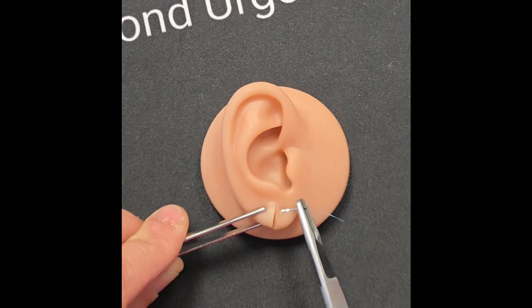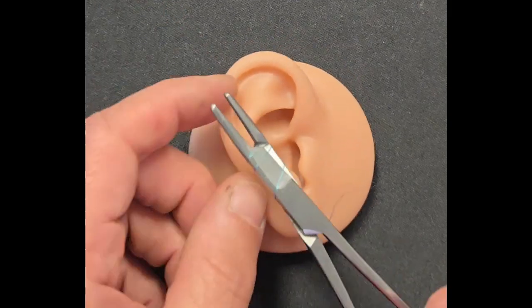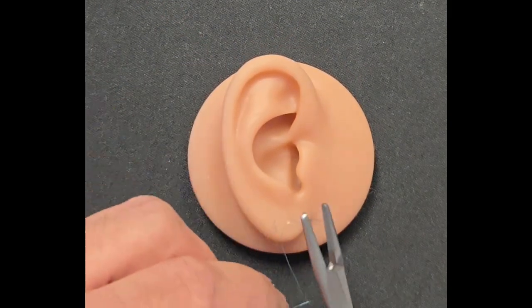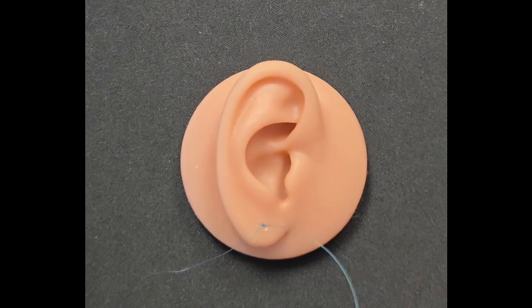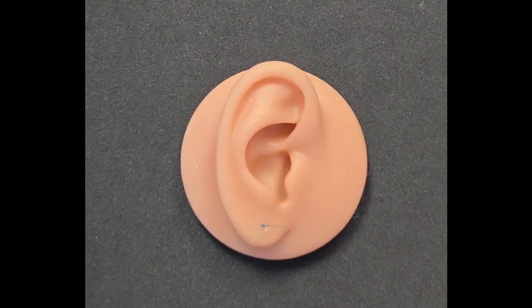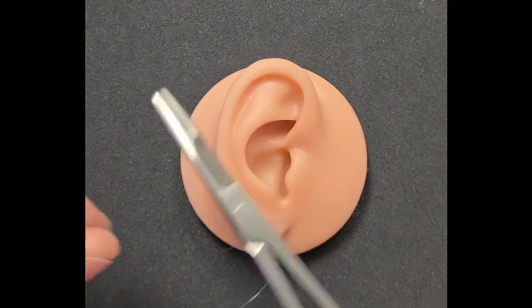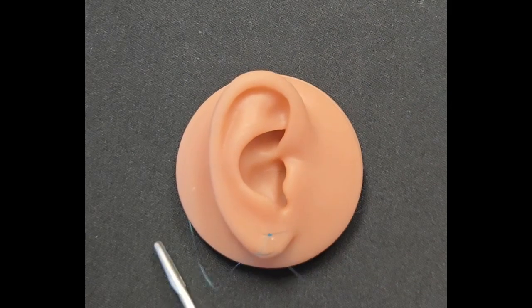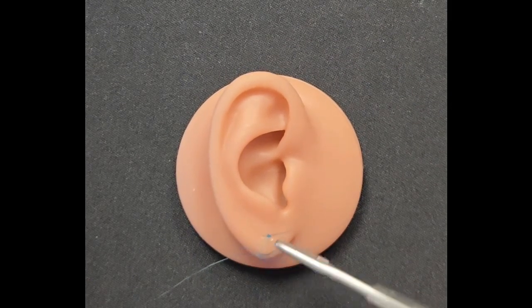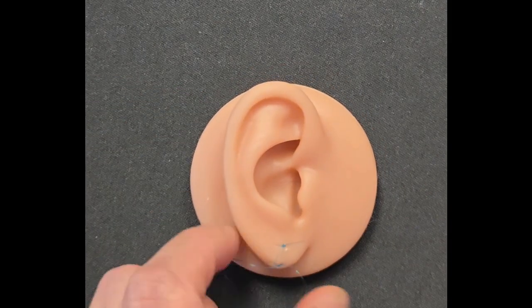All right, we are ready to go. I'm going to throw in two simple interrupted sutures here and close it off, and he's going to be happy. Remember, you can do this for hematoma drainage — for your UFC fighters, MMA fighters, boxers, and obviously trauma lacerations. Nerve blocks are such a good procedure to have under your purview, especially in the emergency room. It helps with pain control, doesn't mess up the tissue as you're trying to suture everything back, and overall makes for a great patient experience and a great repair job.